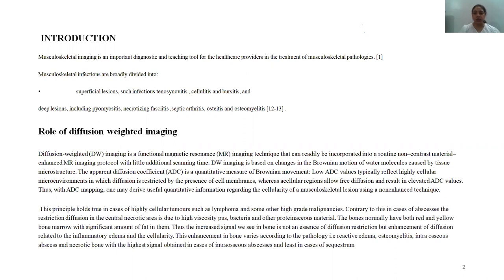Diffusion-weighted imaging is a part of functional MR imaging which can be incorporated into routine non-contrast enhanced MR imaging. It does not require additional timing as is required in contrast imaging, so it can be easily added into routine sequences. DWI is based on the Brownian motion of water molecules caused by tissue microstructures. The apparent diffusion coefficient is a quantitative measure of this Brownian movement.